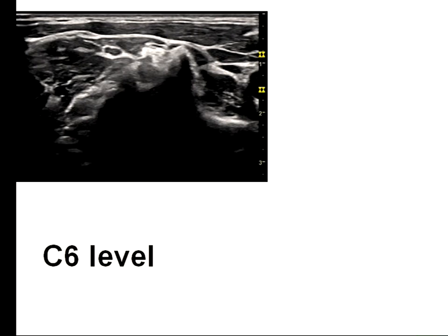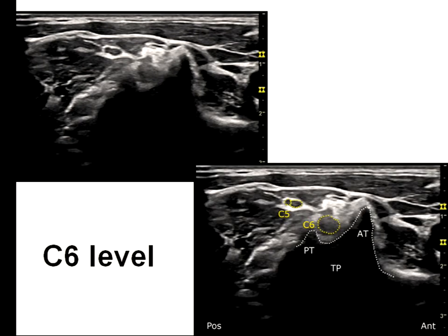Usually it's not in the same area, a little bit anterior, and we'll show it in the workshop. You cannot miss this sharp anterior tubercle. This is medial, lateral. This is the posterior tubercle. All this is the transverse process. This is the nerve root. And you cannot see the vertebral artery because it's hidden inside the transverse process, so with the acoustic shadow, you cannot see it.